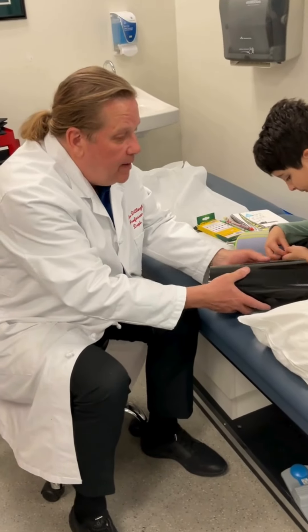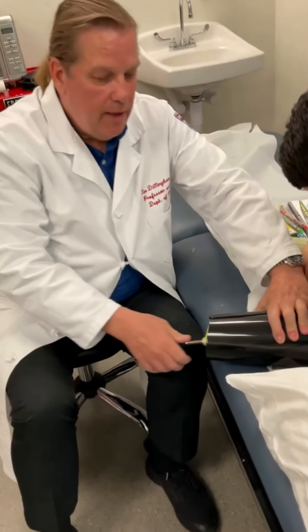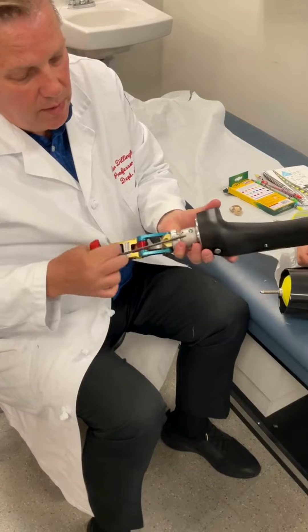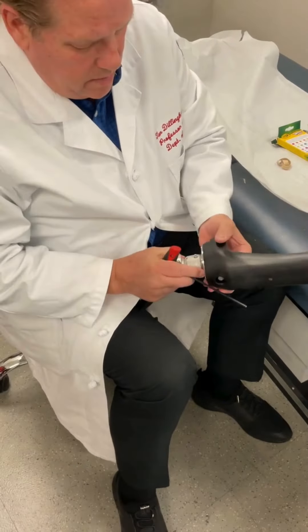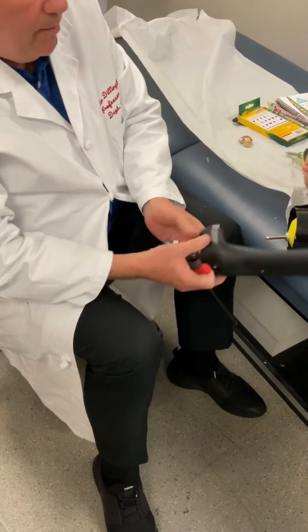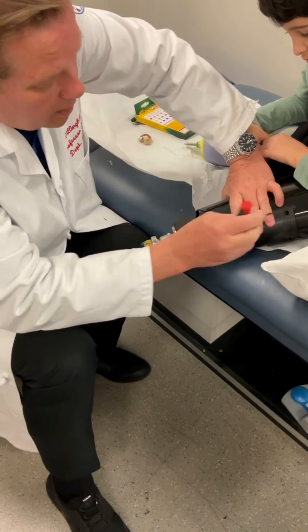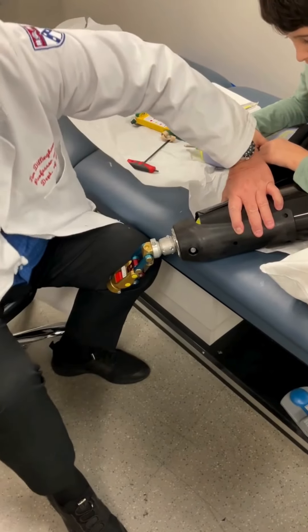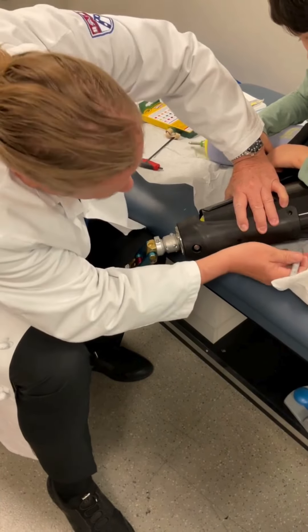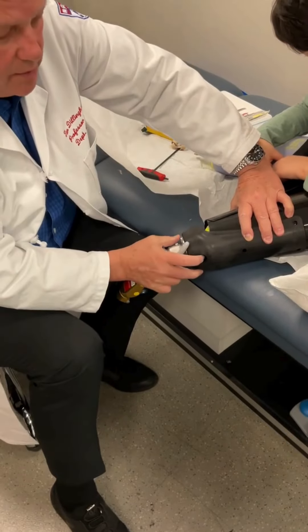And I can simply cut where those marks are at. You just test it out and see how well it fits — it seems to fit pretty well. It goes right around the leg, here you have your pin suspension. Here's what it will look like: it's the prosthesis, it's adjustable. By gently unscrewing the bottom screws, you can get larger or smaller, so you can fit it to where he is at. And he looks to be about that big — fits perfectly. What you'll then do from here is you'll mark holes where you're going to drill holes here. This will be how you attach it to the socket. And here's the pin suspension.